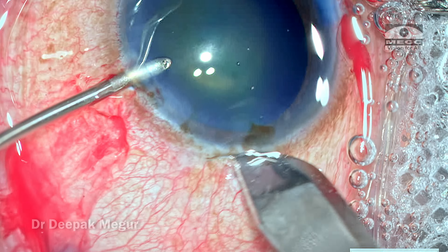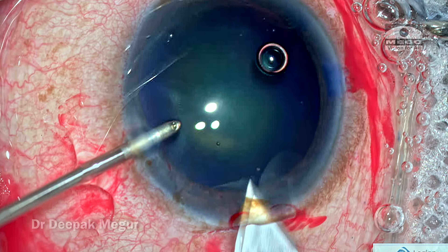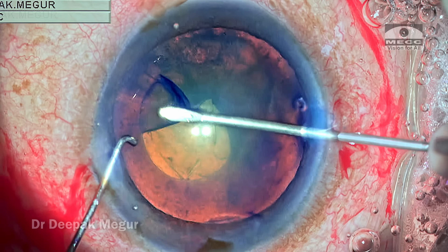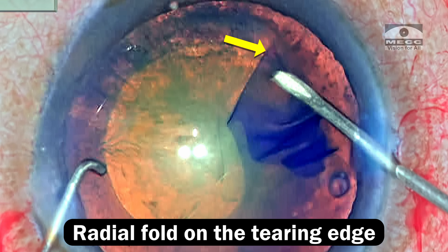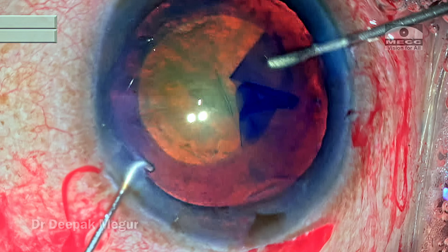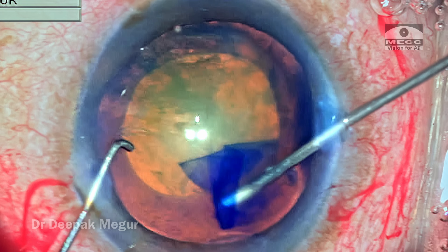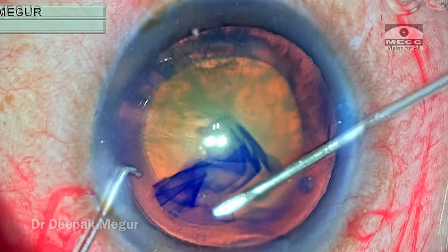The well-dilated pupil doesn't look anything ominous at all. The incisions are made, the capsule is stained. I puncture the capsule and raise the flap, and as I'm tearing the capsule with my rhexis needle, I'm beginning to see small radial folds along the tearing edge. This was a sign of concern — I suspected anterior zonular weakness, but I never thought it would be very alarming.